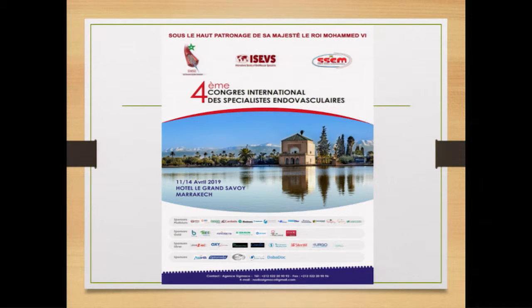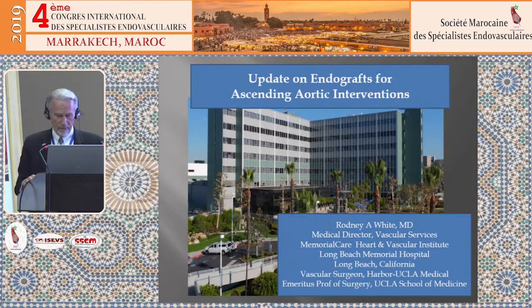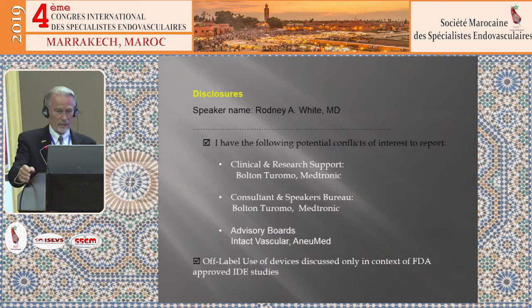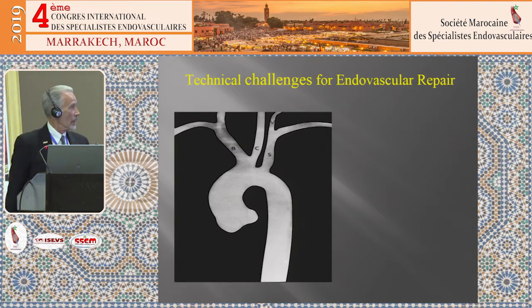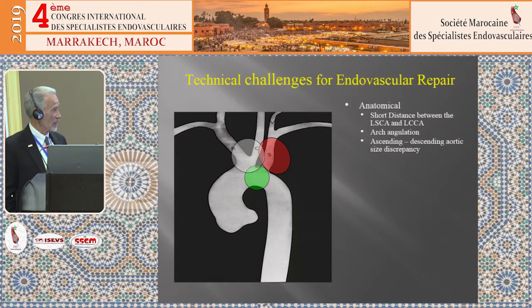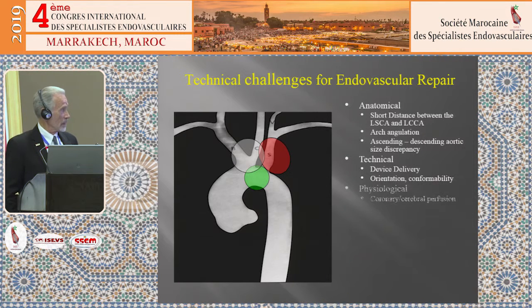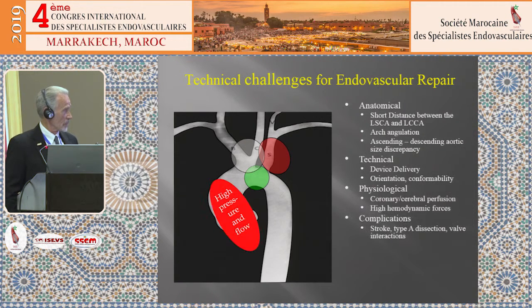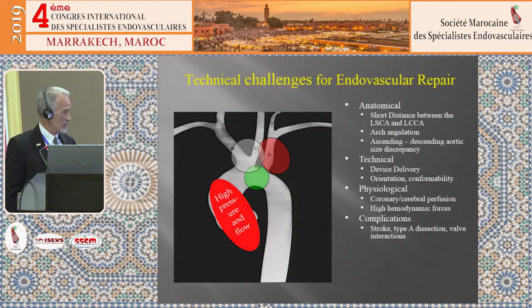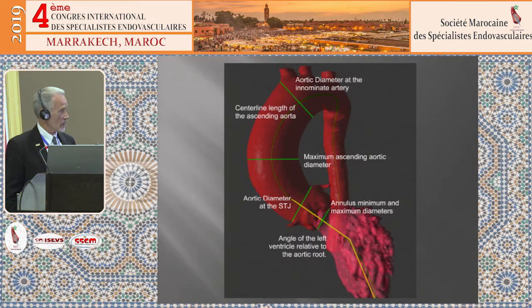The first two talks combine two new areas in the treatment of endovascular therapy. The first one is the use of these devices in the ascending aorta, which we all know is a complex anatomy, where there are differences in terms of the anatomy where we deal with the subclavian artery, the proximity of the other vessels to the head, and then the dynamics of increased flow and pressure in the ascending aorta, so that some of the things that we see in other cases are more difficult here.